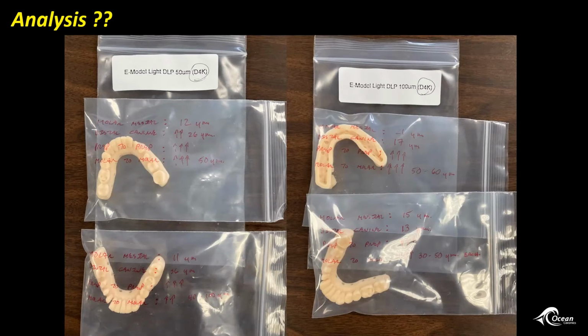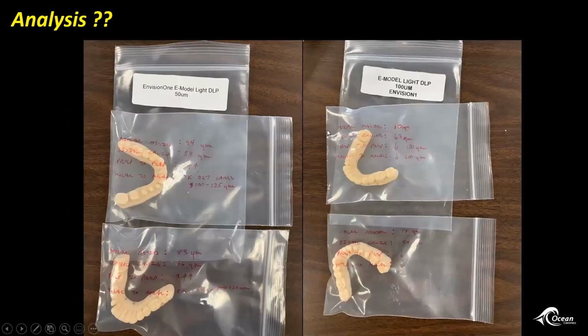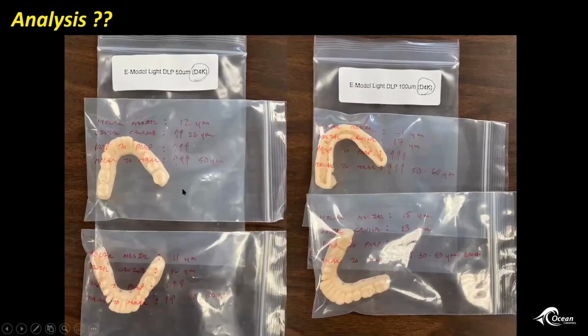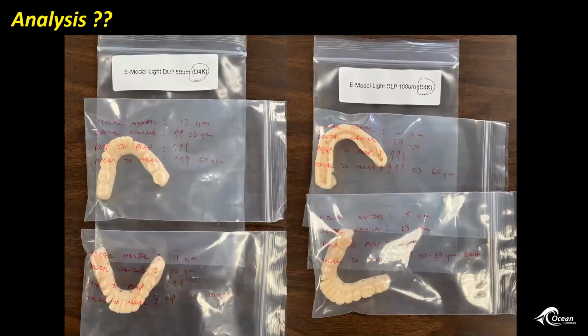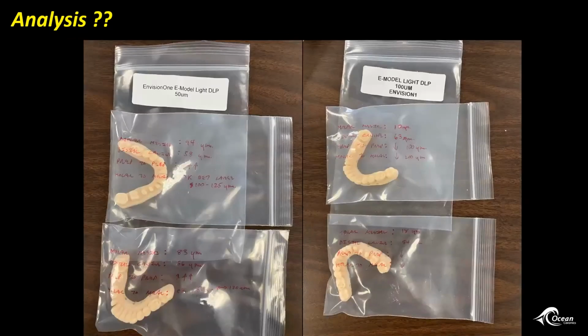I sent this file off to EnvisionTec, and I said, I want to test the accuracy of your printers. So they sent me back models from their D4K printer and also their Envision-1 printer. I did an analysis similar to what I was showing you before. What I determined was that their D4K printer was putting out really, really good accuracy. On the Envision-1, we had arrows pointing down, which is not good. But once again, I was testing cross arch, linear evaluation, and contact accuracy. So we did get some decent results on the D4K, and we moved on.